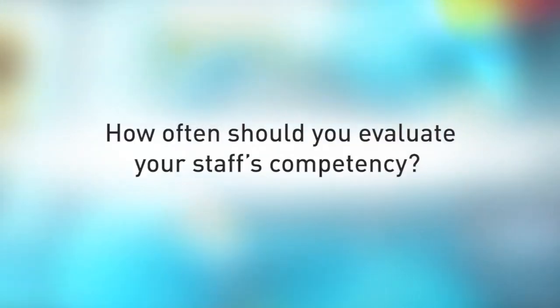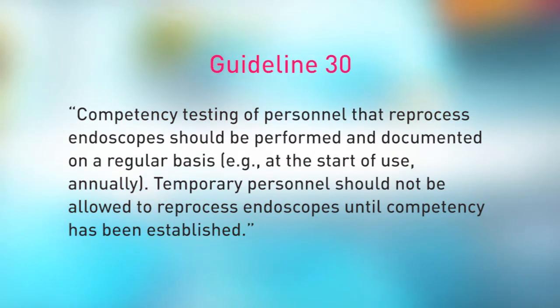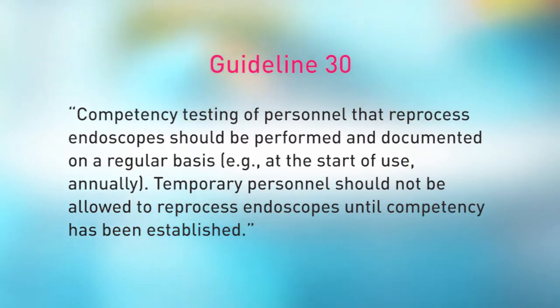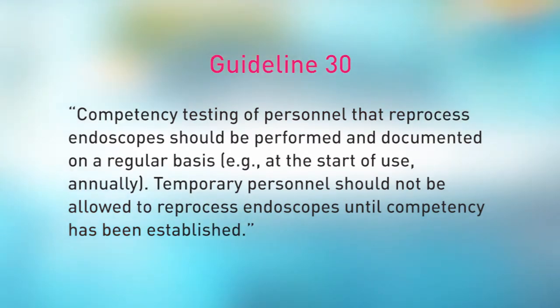How often should you evaluate your staff's competency? ASGE Guideline 30 says, competency testing of personnel that reprocess endoscopes should be performed and documented on a regular basis, for example, at the start of use or annually. Temporary personnel should not be allowed to reprocess endoscopes until competency has been established. This stresses the importance of having your staff be properly trained before they begin using high-level disinfectants. It is necessary to perform regular competency testing to ensure proper procedure is being followed at all times.